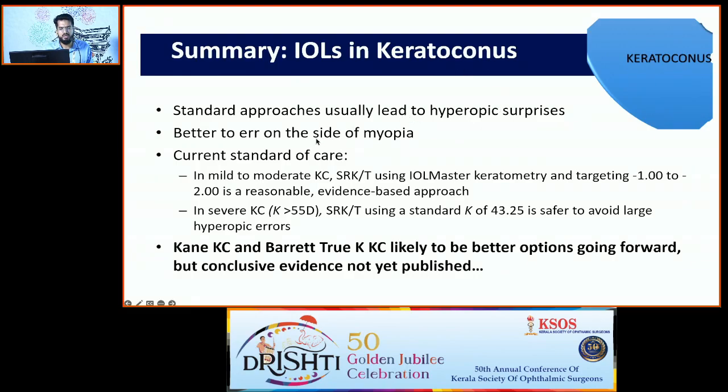And usually after cataract surgery, it will be better to target a myopic power. So if you are dealing with a mild to moderate KC, you can always go about the SRK/T and keep a target myopia of -1 to -2 to be on the safer side. But if you are already dealing with a severe KC and you don't know what K would be, plan an SRK/T with a standard K of 43.25.